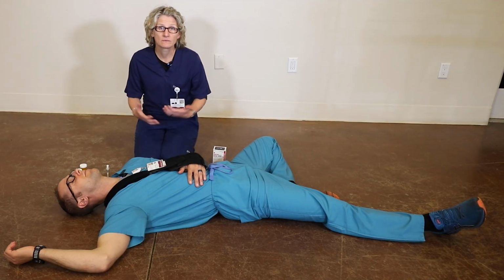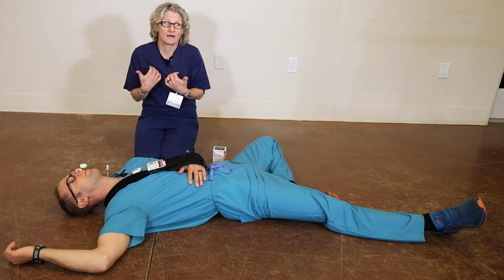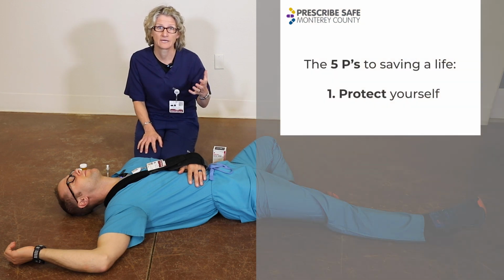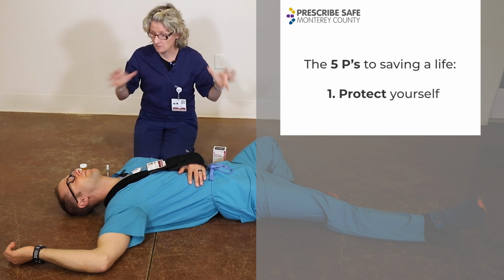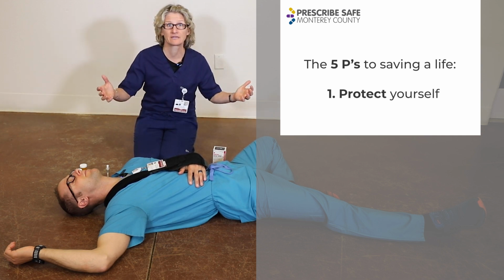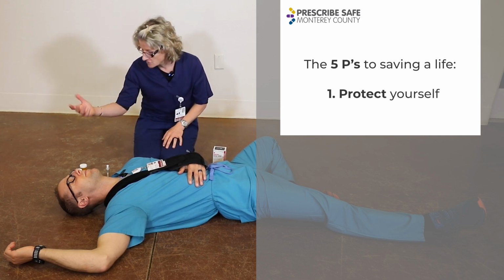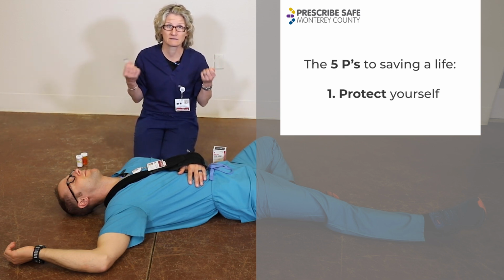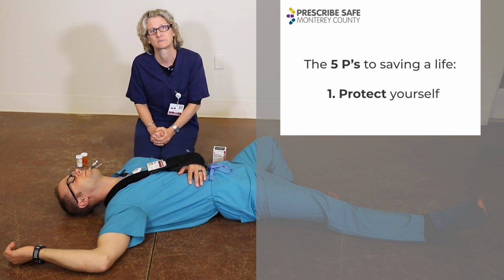All right, so now what we would like to do is to simulate a potential overdose situation so you can see how I would respond in this type of scenario. So the first P was protect yourself, and as is evident with what we hear when we get on a plane, put on your own face mask first before you put on someone else's. So at least make sure the scene is safe. If you're in traffic and trying to respond to an overdose, that's a more dangerous situation for both of you. So there may be pills on scene, there may be sharps or needles on scene, capped or uncapped. Just please make sure that you are safe so you can actually attend to someone who's potentially overdosed.